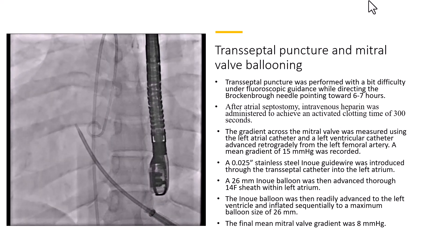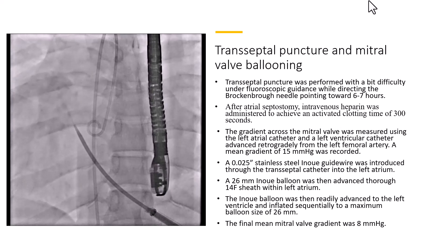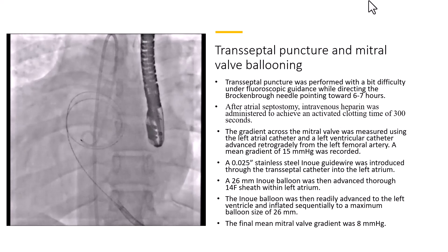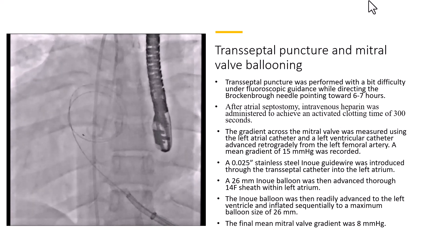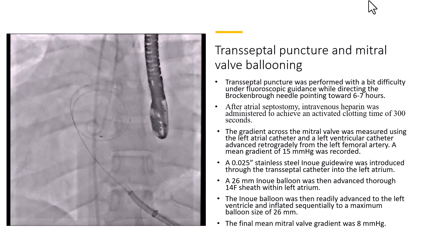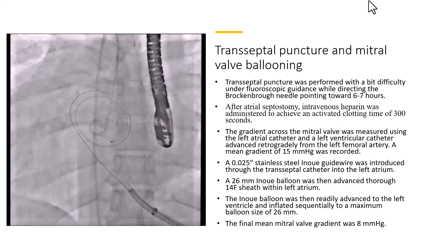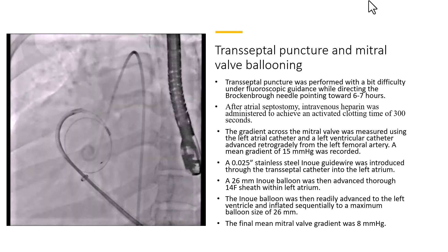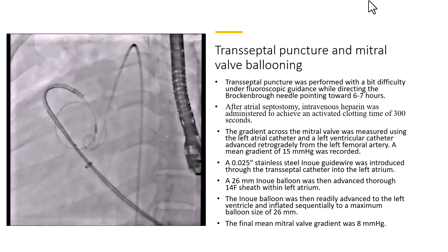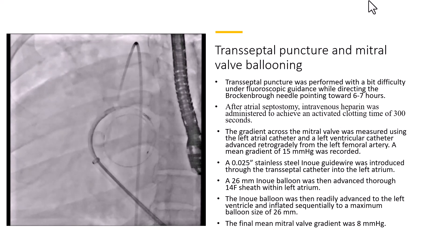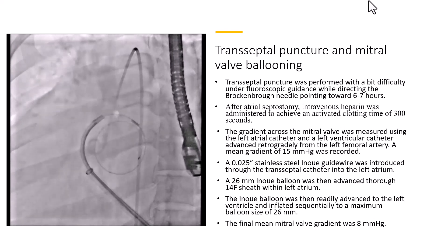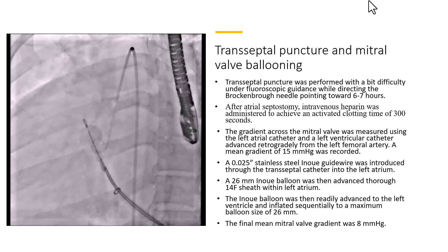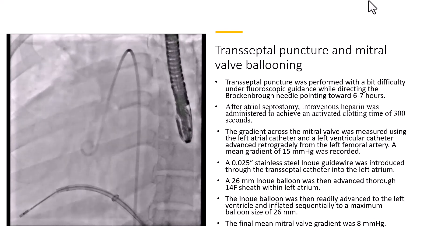After atrial septostomy, intravenous heparin was administered. The gradient across the mitral valve was measured at about 15 mmHg. A 0.025-inch stainless steel Inoue guidewire was introduced through the transseptal catheter into the left atrium, and the 26 mm Inoue balloon was advanced through the 14-French sheath within the left atrium. The balloon was advanced to the left ventricle and inflated sequentially to a maximum balloon size of 26 mm. The final mitral valve gradient decreased to 8 mmHg.